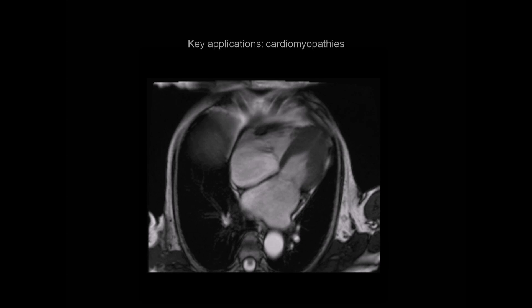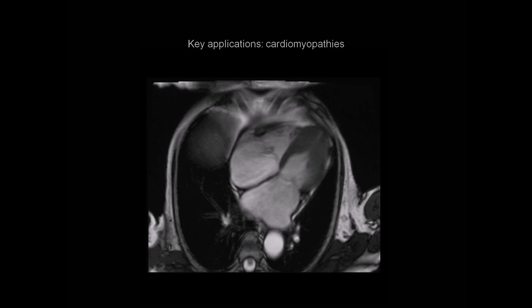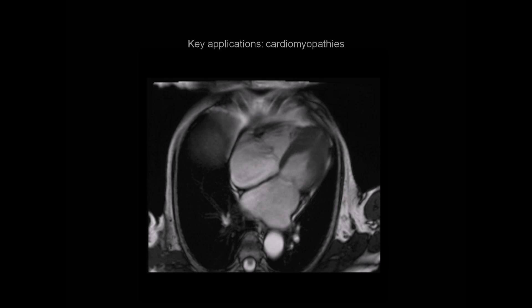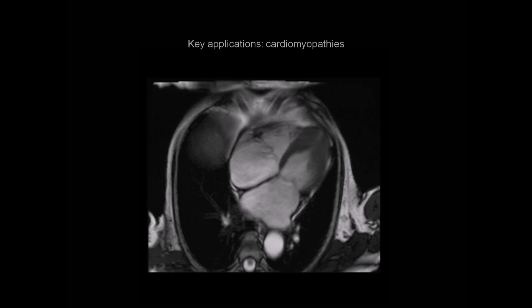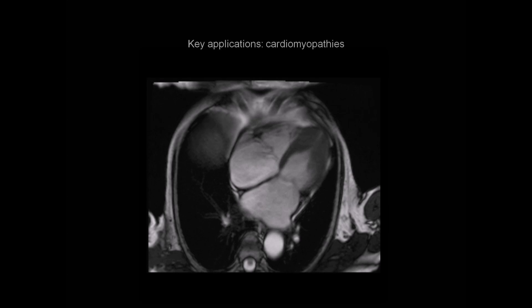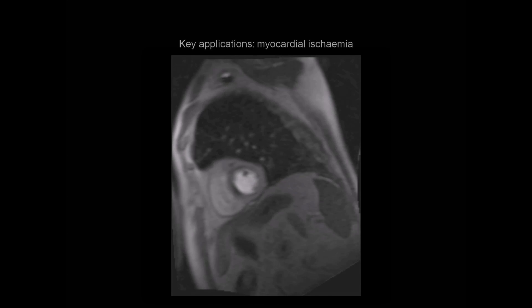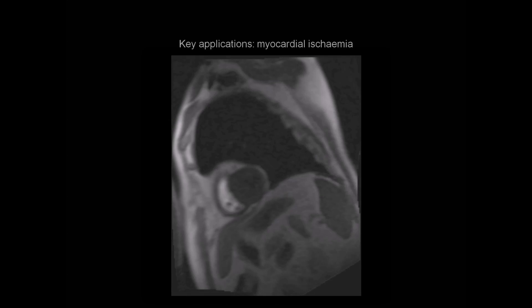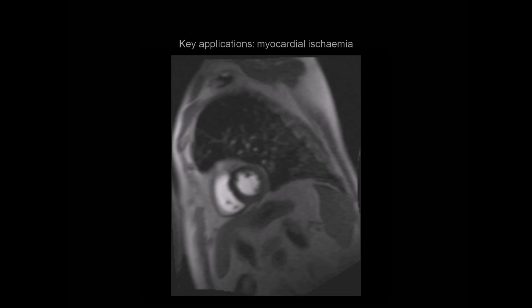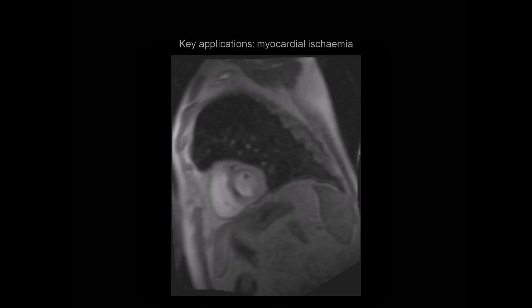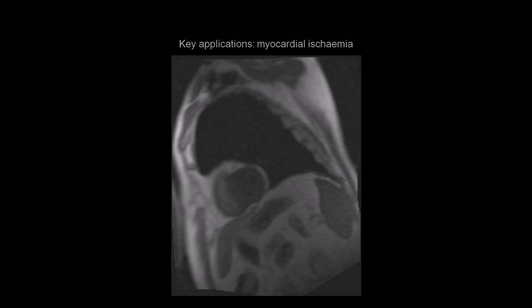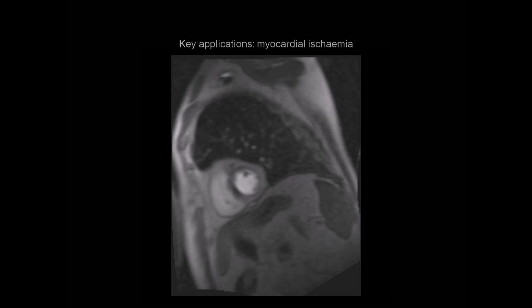CMR is also commonly used to assess the cardiomyopathies, including ischemic cardiomyopathy, dilated cardiomyopathy, and as in this example here, hypertrophic cardiomyopathy. CMR is also commonly used in the assessment of myocardial ischemia, as in this myocardial perfusion study in a patient with LAD disease, shown here.